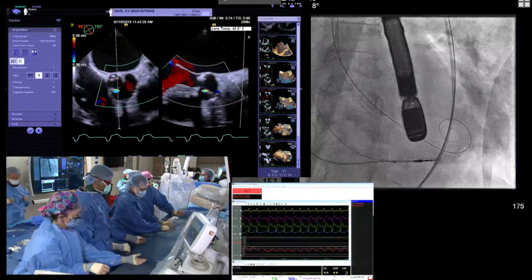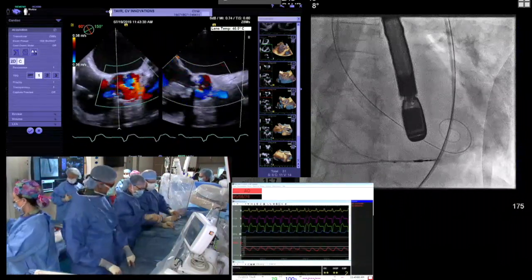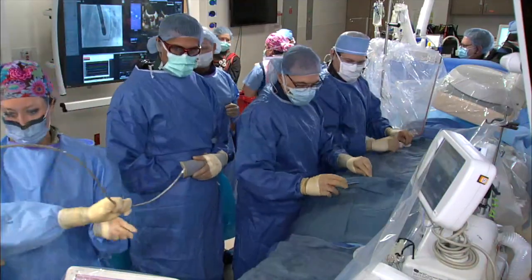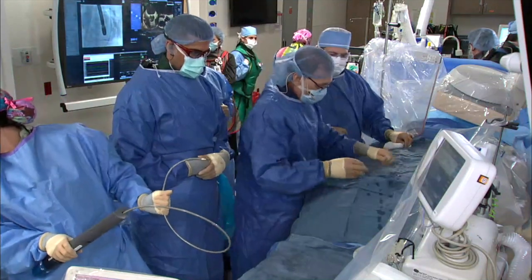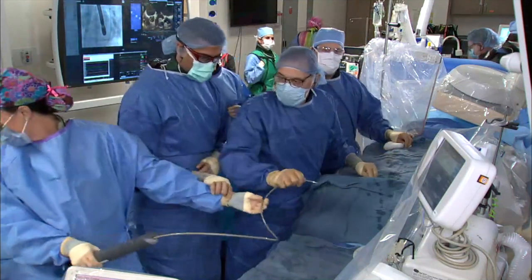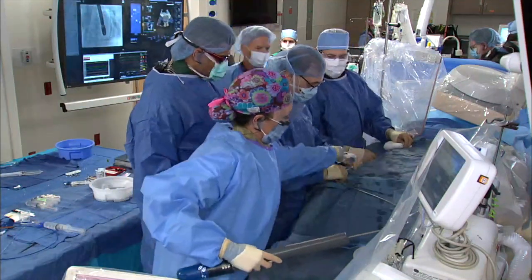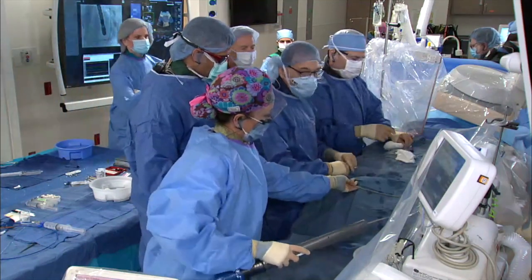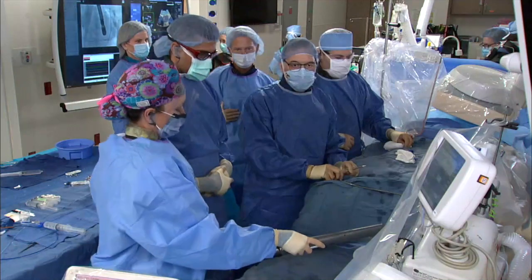Dave, I was going to just ask that. It sounds like when we start a program, when we start doing these LOTUS cases, it probably would be worthwhile to do a valvuloplasty. I don't really see a downside. If you get a ton of PV leak, you can just go ahead and quickly put the valve in, and it seems like it makes the deployment of the device a little bit more routine. You don't have to do as much repositioning if you've got the valve already partially open.